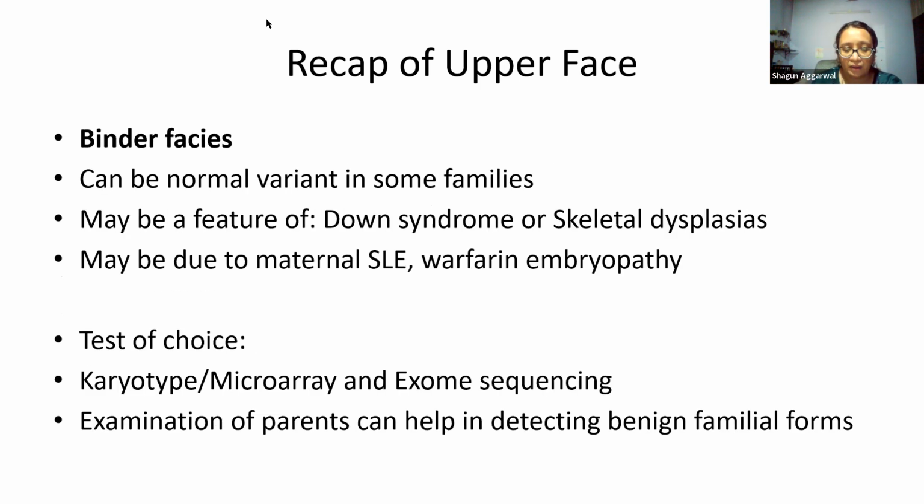The next thing we discussed was binder faces, which is basically more of a dysmorphic face rather than a malformation per se. We also saw through one case how this can sometimes be just a normal variant, a benign finding in some families. But on the other hand, it could be part of Down syndrome, it could be part of a skeletal dysplasia. Sometimes it could be caused by certain teratogenic effects, like mother taking warfarin, or mother with SLE.